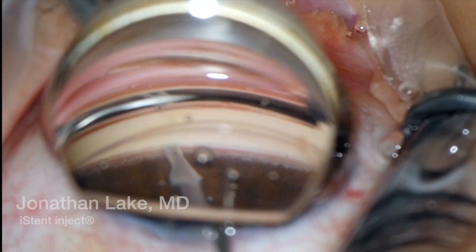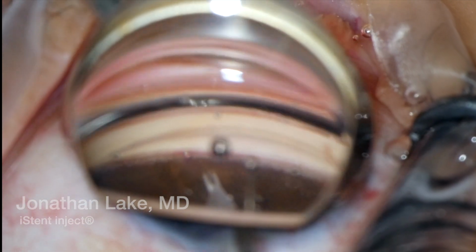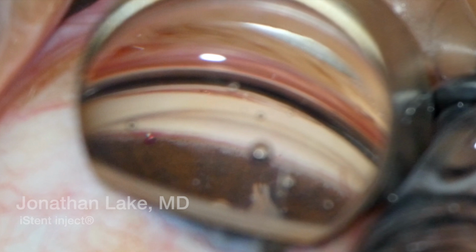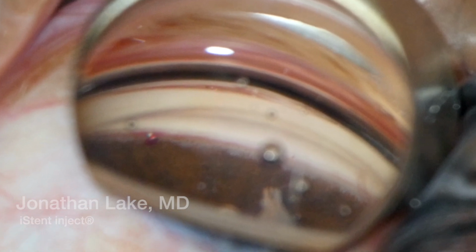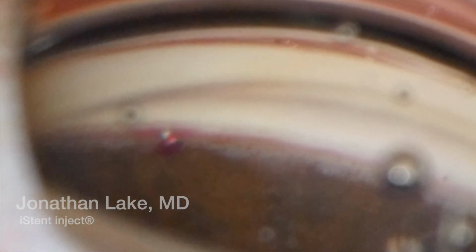So here we see the first implantation. Here we hear the click and then the charge. And if you look at it, although there's bleeding, which means that it is within the trabecular meshwork, it wasn't really implanted where we wanted it to be. So what we do right now is just proceed as usual.